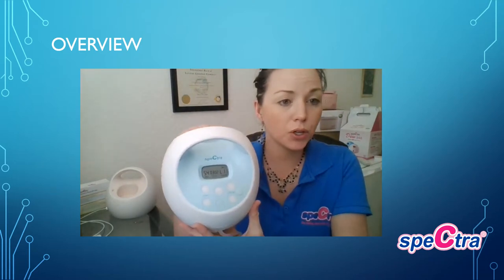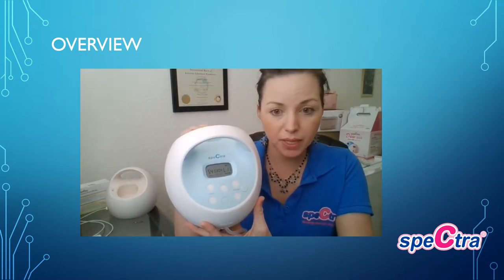The pump will shut off automatically after 30 minutes of pumping. When you turn it back on, it will remember your customized pumping settings.